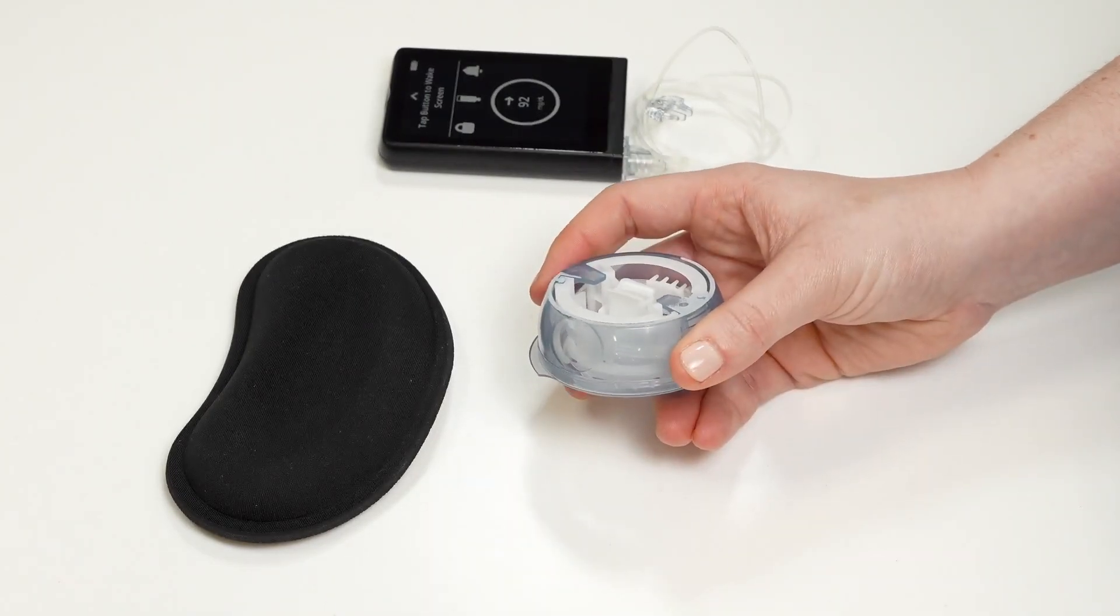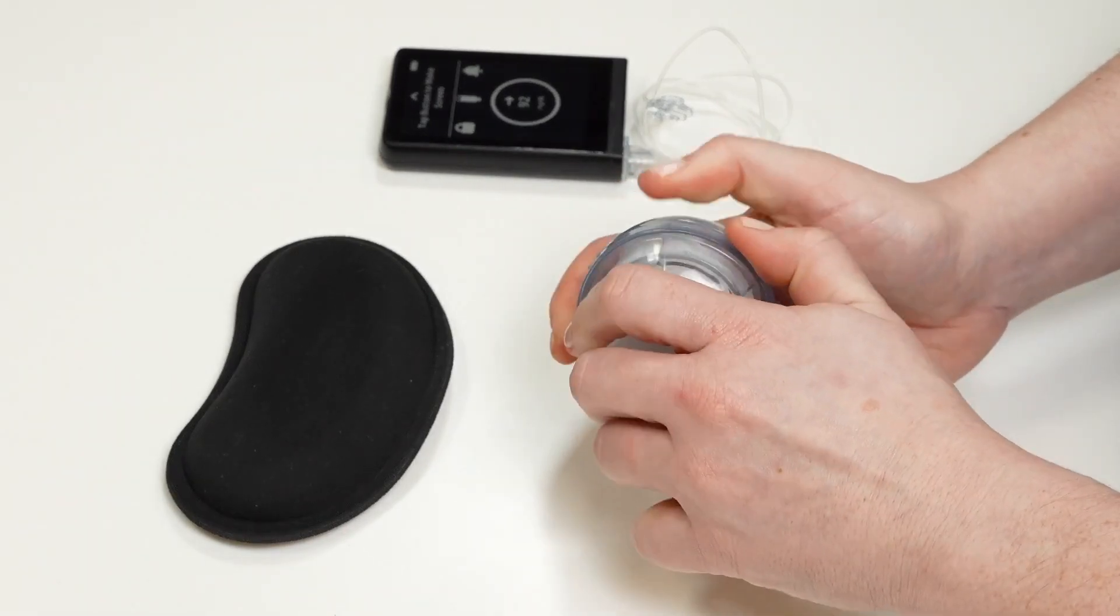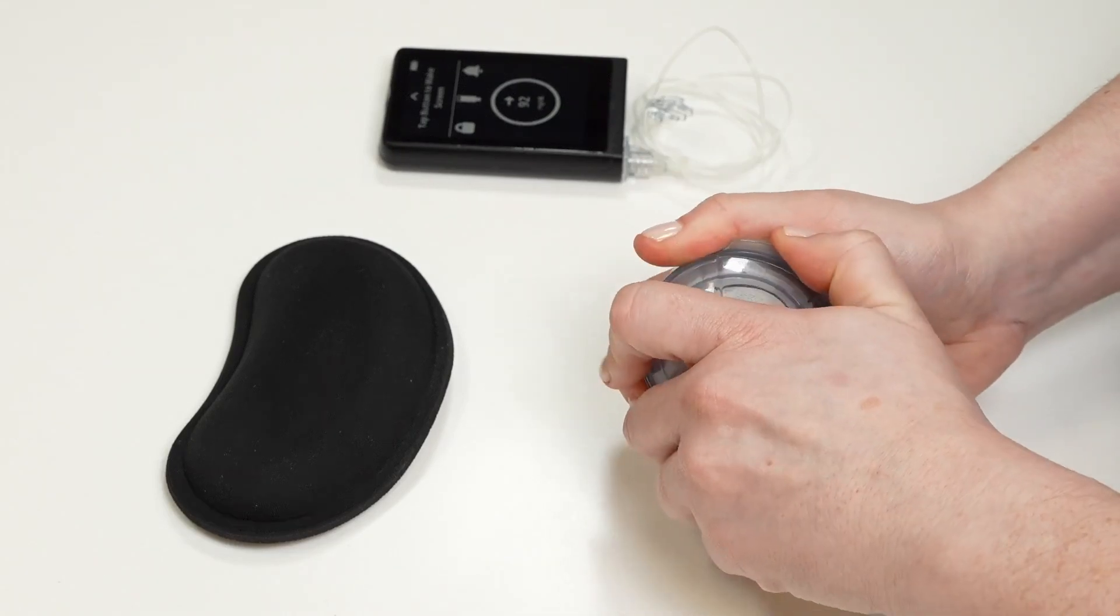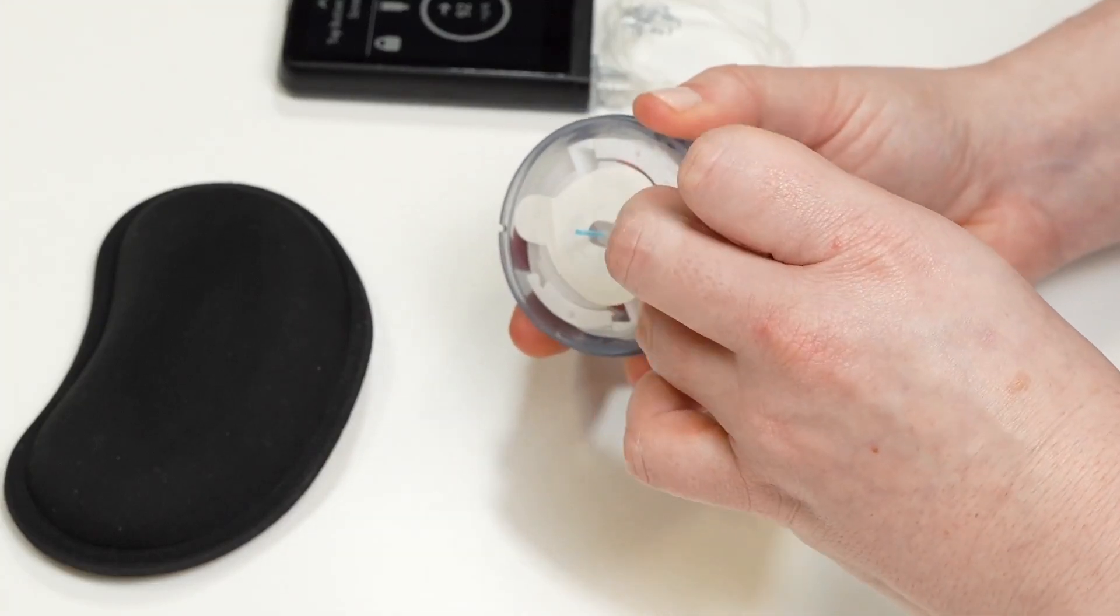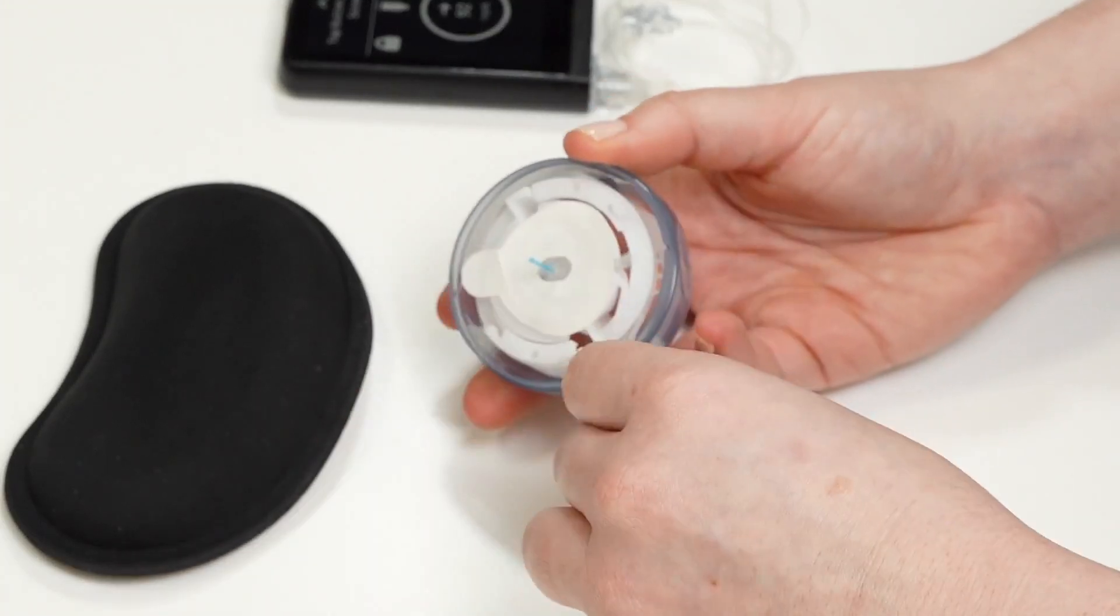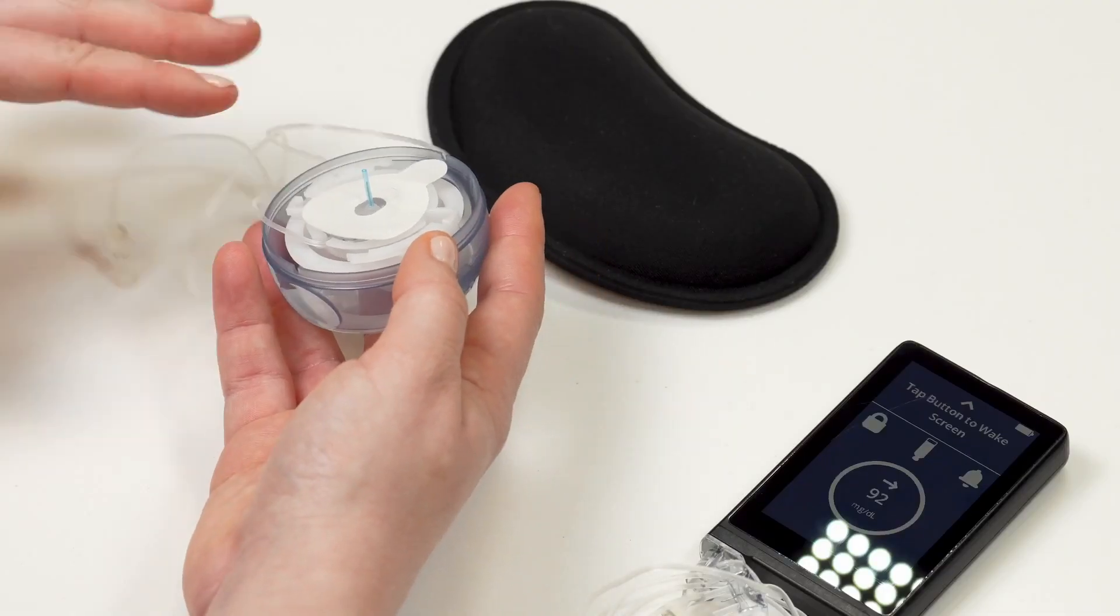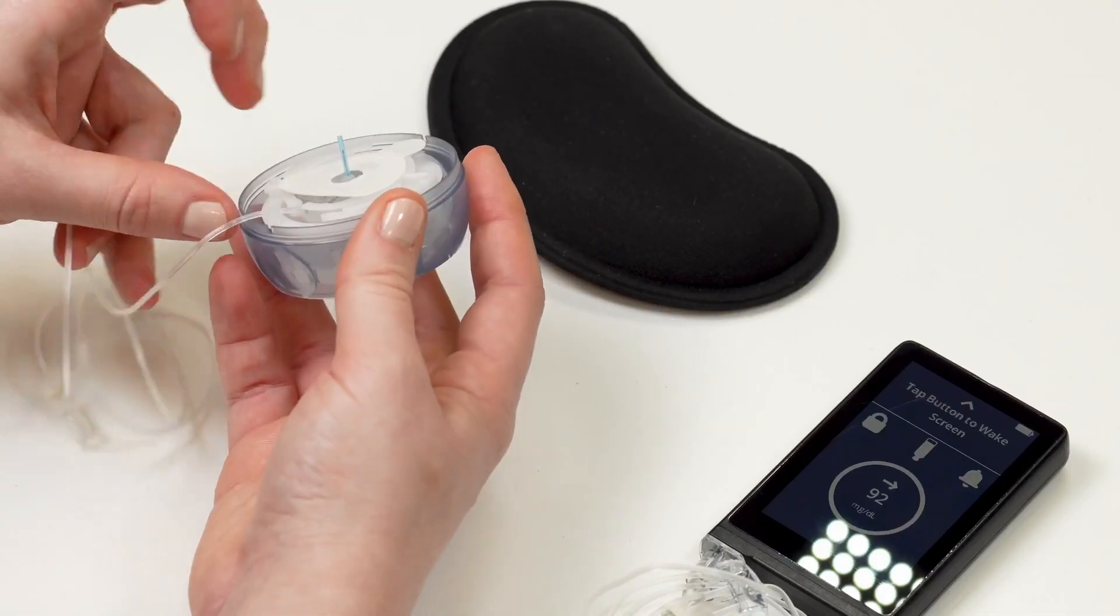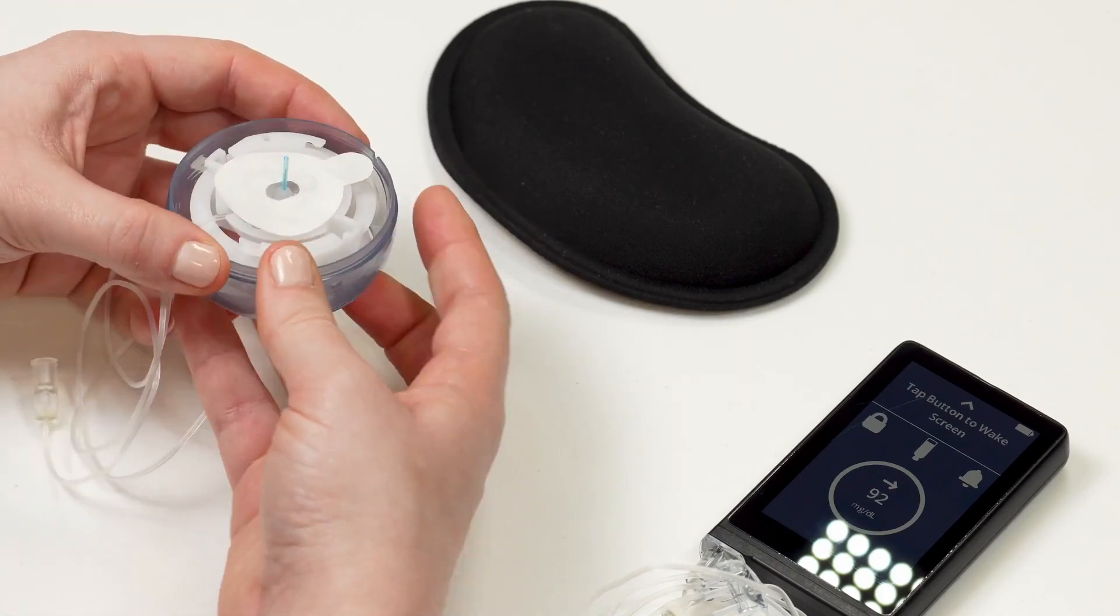Then, use the handle to pop open the top of the infusion set. Gently unhook the tubing and slowly unwrap it from the inserter. Carefully tuck the tubing out of the way using the small indents on the edge of the infusion set inserter.